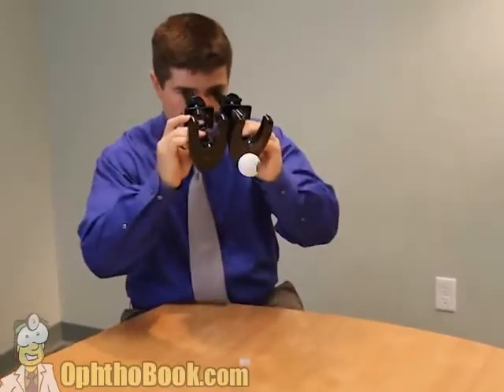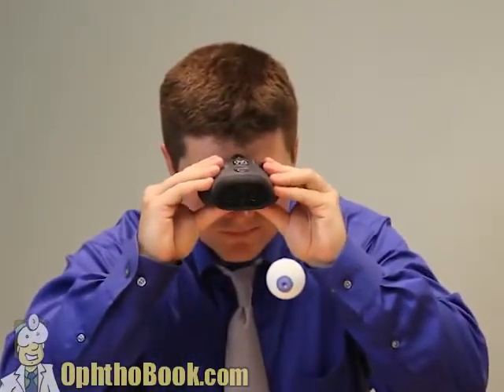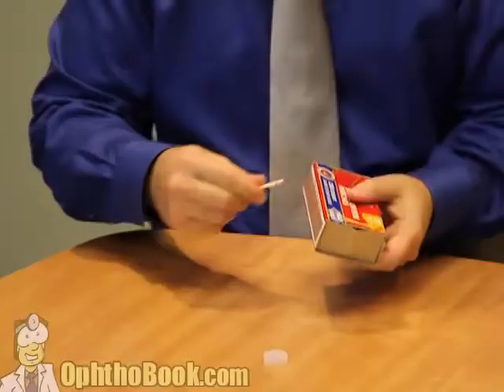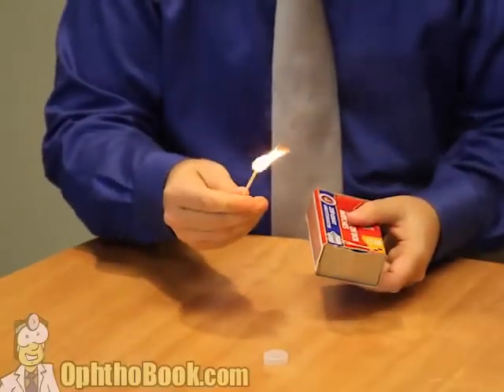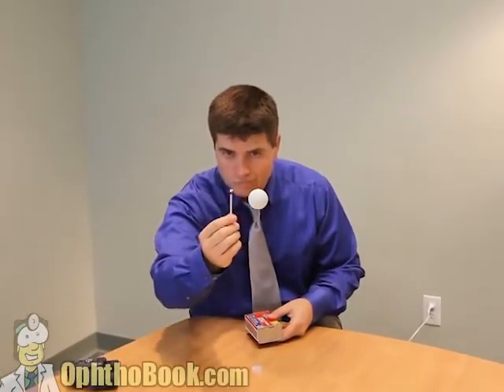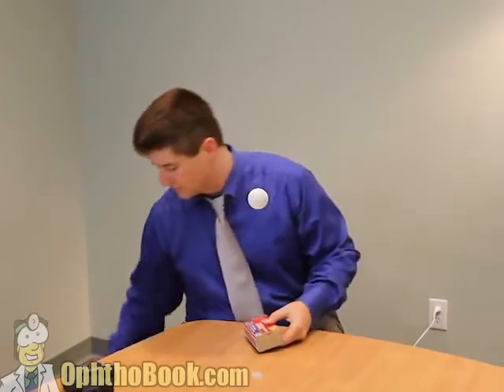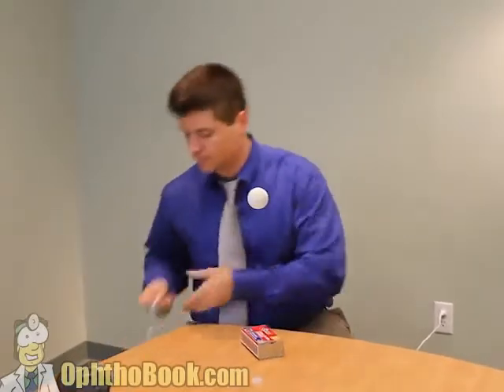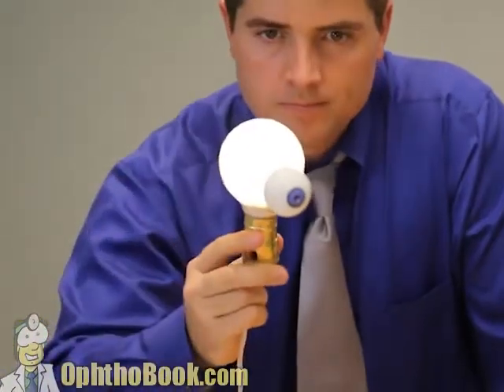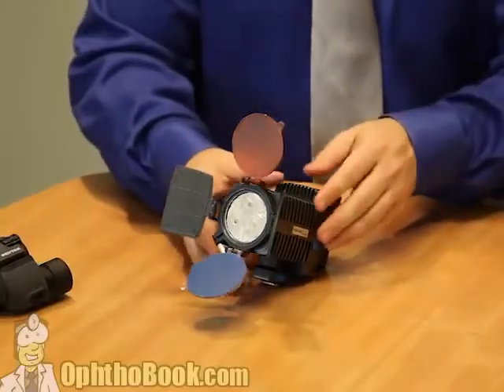Let's improve our design by creating a binocular microscope, 2 of them, but let's meld these together into a single unit so that they're in focus and synchrony with each other, and this is basically the perfect microscope. So far, so good. Now we need a light source. Early microscopes used the sunlight or even flame, a candle, to look at the eye, but it's just not enough light, and as we know, the eye is sensitive to flame. So with the invention of electricity and the light bulb, we improve our design and start using a light bulb to see what we're doing. But once again, not ideal.